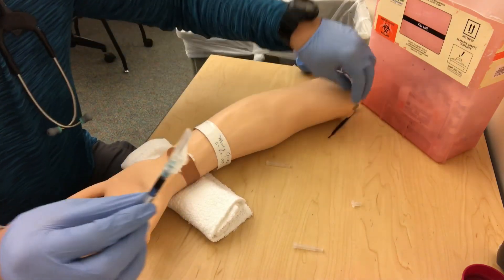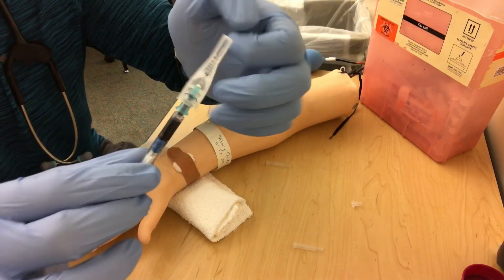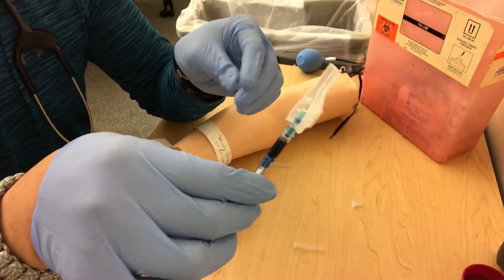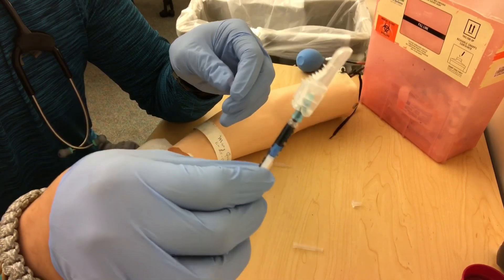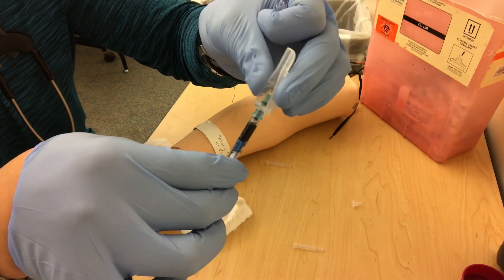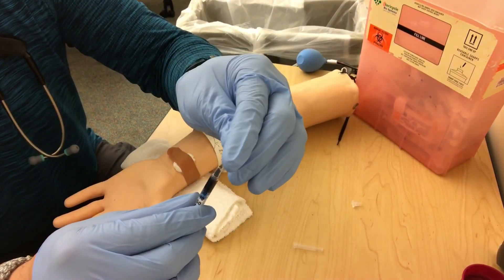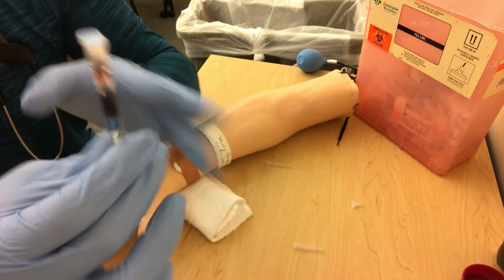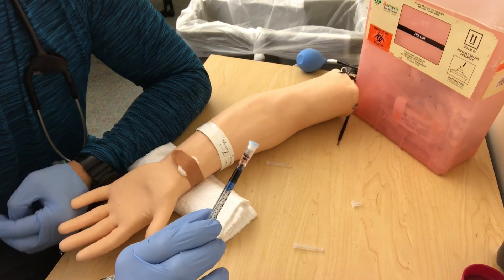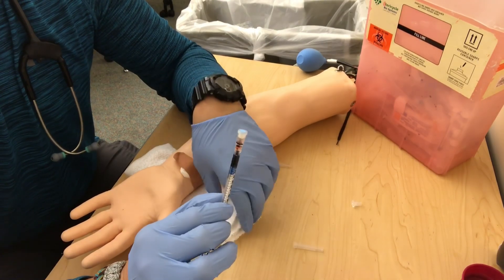We have our needle capped. Make sure all the bubbles are out of the sample. The sample may look venous — sometimes with severe hypoxemia patients will actually have dark blood — but if it comes up fast, it's usually arterial. Don't give up too quickly. Put it in a sharps container, squeeze the cap to get all bubbles out, and get this ready to run. We want to run this within ten minutes for accuracy — that's the new guideline. If you're sending it to the lab, get it there immediately without putting it on ice.